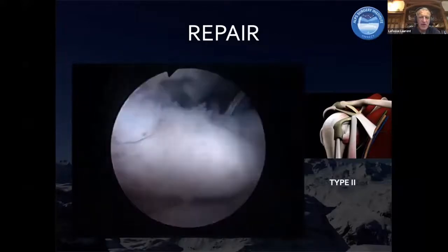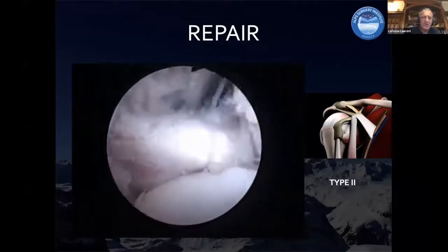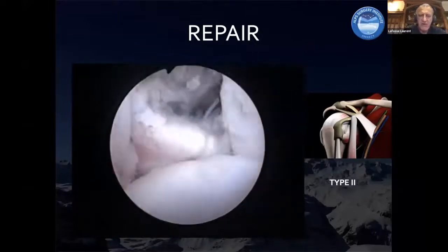It's even important to cut the biceps in these cases, because otherwise the biceps will be squeezed and will be responsible for the pain post-op.